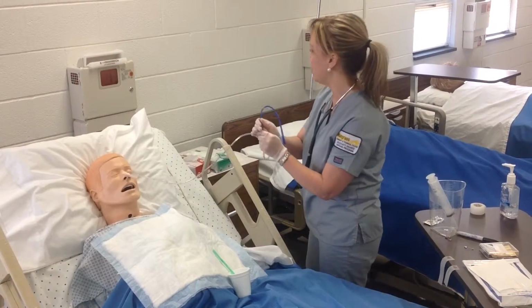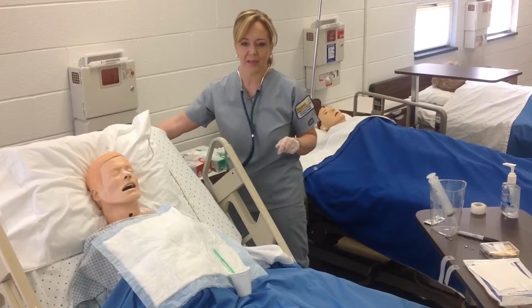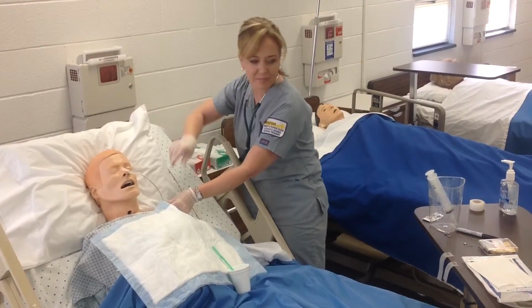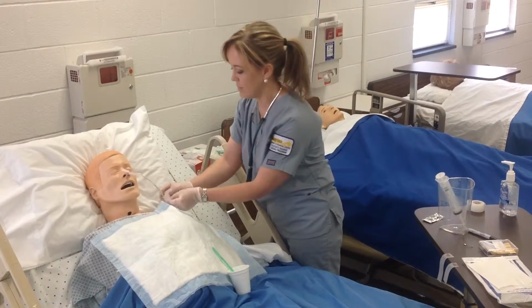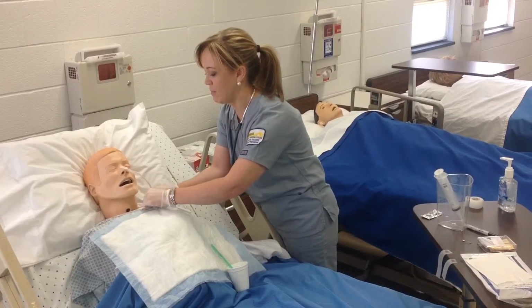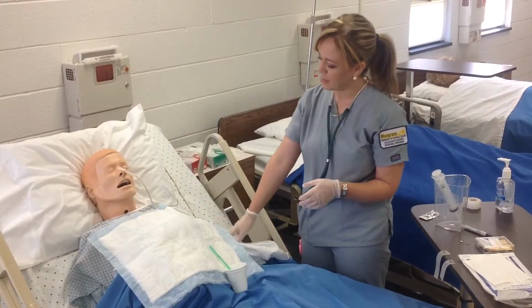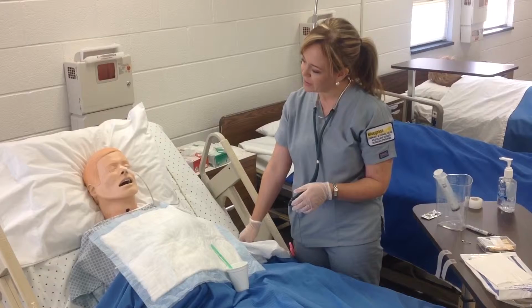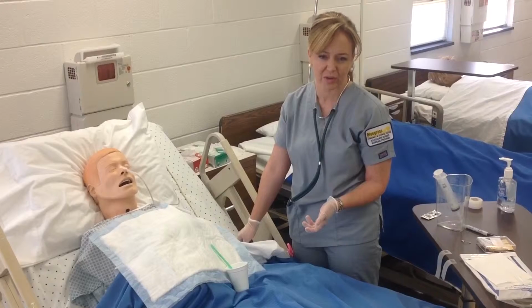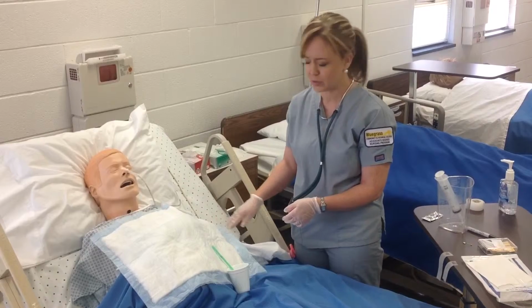So I'm going to connect this to the suction. But first I want to attach it to his gown. Okay. The next thing we're going to do is ensure his comfort. How are you doing? And he seems to be doing okay. We want to document how the patient tolerated the procedure. We also want to provide some oral hygiene care for him to be sure he's comfortable.